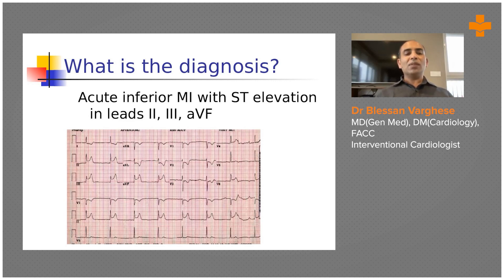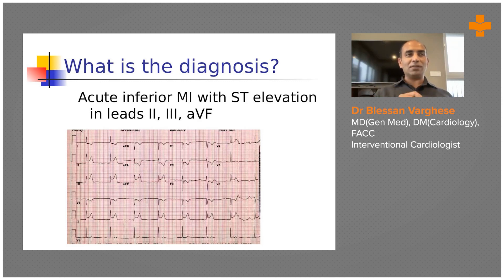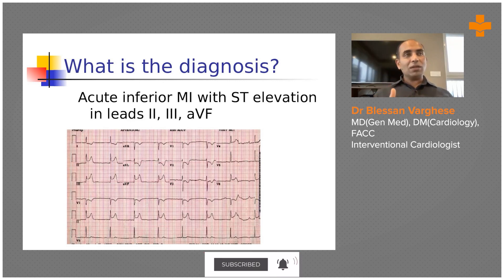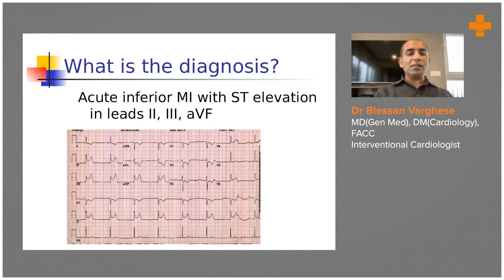This ECG shows ST elevation in leads 2, 3, and AVF. When we say ST elevation, it is the J point elevation. The J point is where the QRS complex ends and the ST segment begins - at the end of the S wave, or at the end of the downslope of the R wave. Not every lead necessarily has an S wave, so it's the end of the QRS complex where the ST segment starts. When the J point is elevated, that is ST elevation diagnostic of acute coronary syndrome - here it is a clearly inferior wall myocardial infarction.